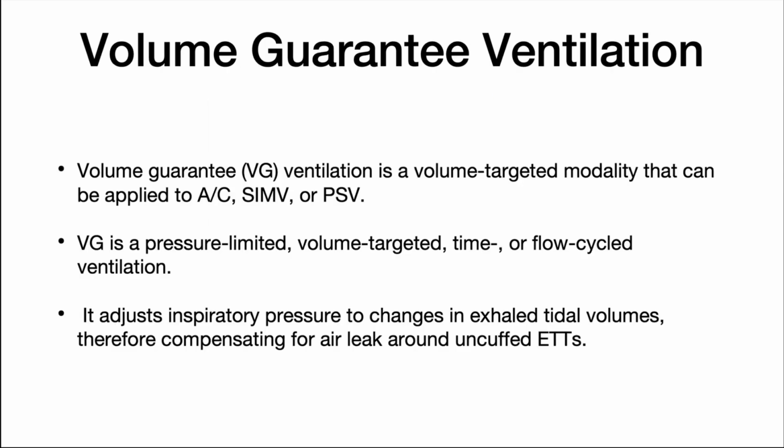Volume guarantee ventilation is a volume targeted modality that can be applied to assist control, SIMV, or pressure support. Volume guarantee is a pressure limited, volume targeted, time or flow cycled ventilation mode. It allows adjustment of inspiratory pressure to changes in exhaled tidal volumes, therefore compensating for any air leaks around uncuffed ET tubes. Volume guarantee has been primarily used in neonates and is shown to be both feasible and effective.